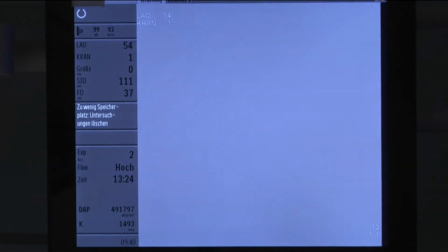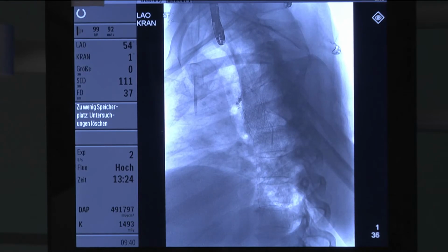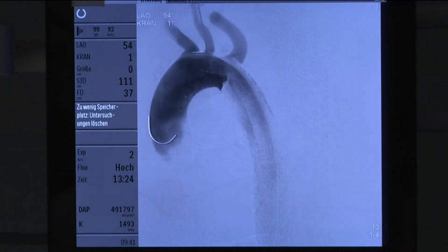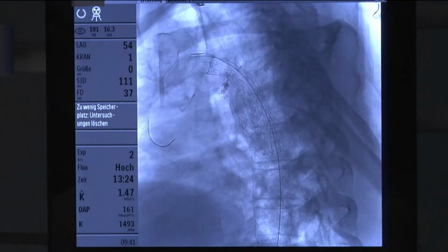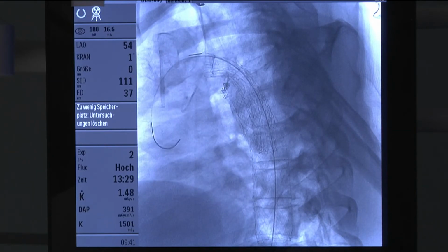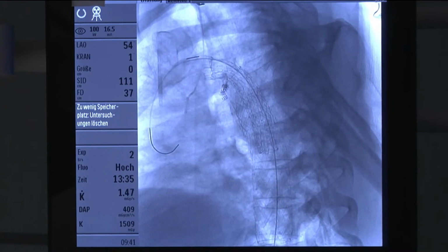Are there any questions at this point? Did you do a left cervicotomy to get the pigtail catheter down? Yes, we did a small incision to prepare cut down access for the left carotid. I think that's great. It's very safe. Yeah, we do it as safe as possible, because like I said, we have very small distances, and we need to be certain that we're not overstenting anything, covering anything. Very nice. Do you consider more angle now? Yes, we're giving more angle. Okay, so that's nice. And at this point, we will deploy fully to its full extent.